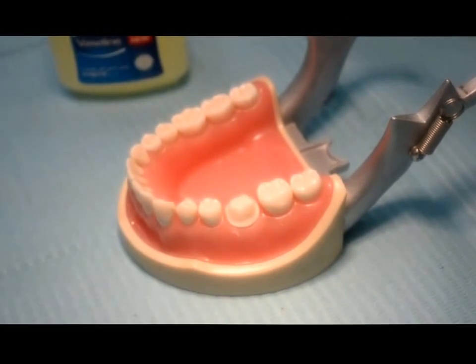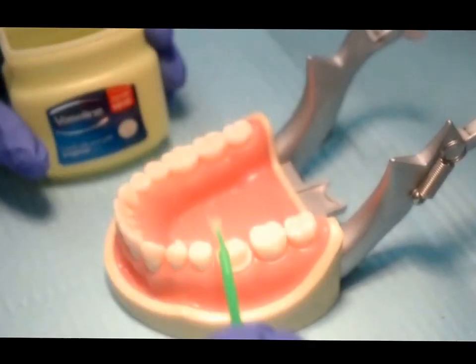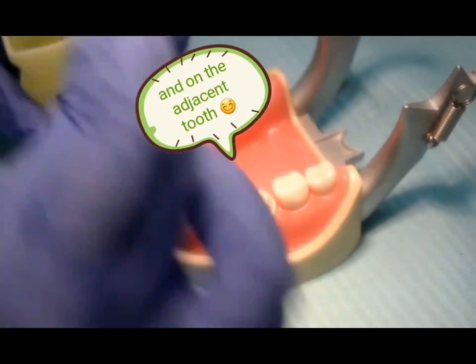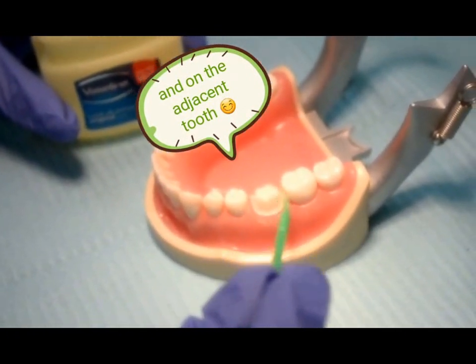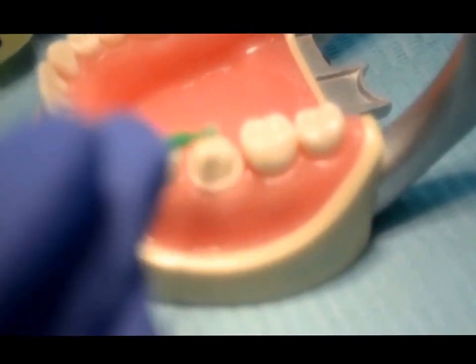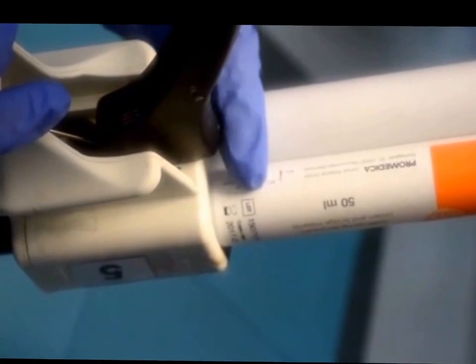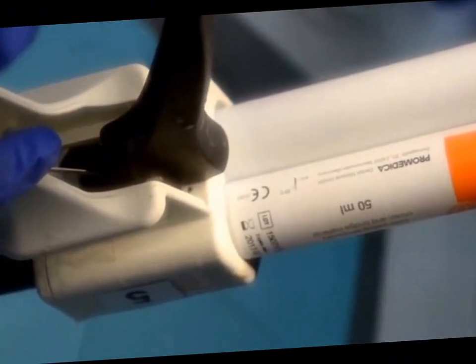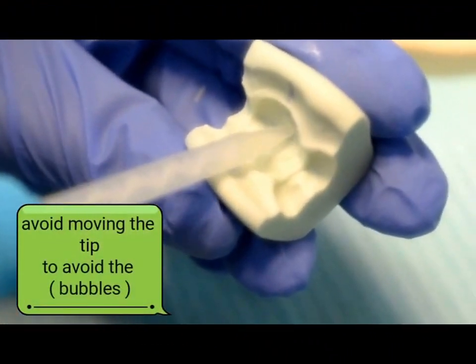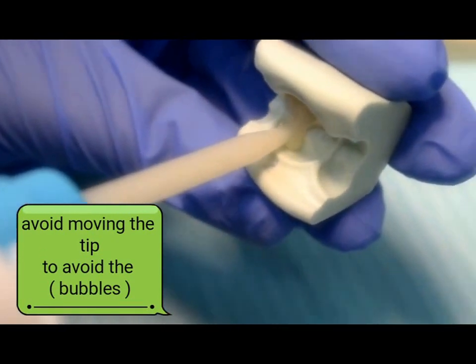After we prepare the tooth, we have to start temporary material manipulation. We use first the petroleum gel on the prepared teeth. You have to check that the acrylic material is sufficient for the prepared tooth.